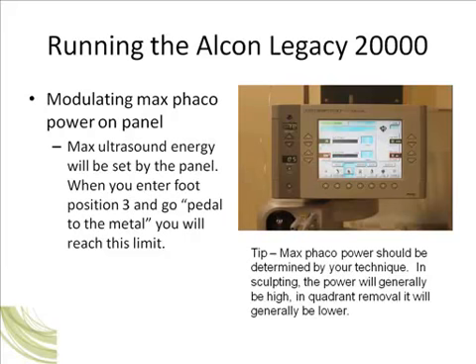Generally, your maximum phaco power is going to be determined by your technique. For example, in sculpting during a divide and conquer technique, you will actually use a slightly higher energy than you would normally, for example, with burst when you're doing chop techniques.